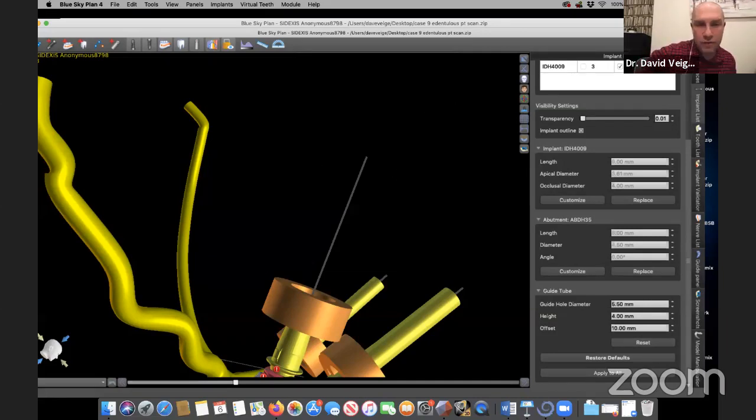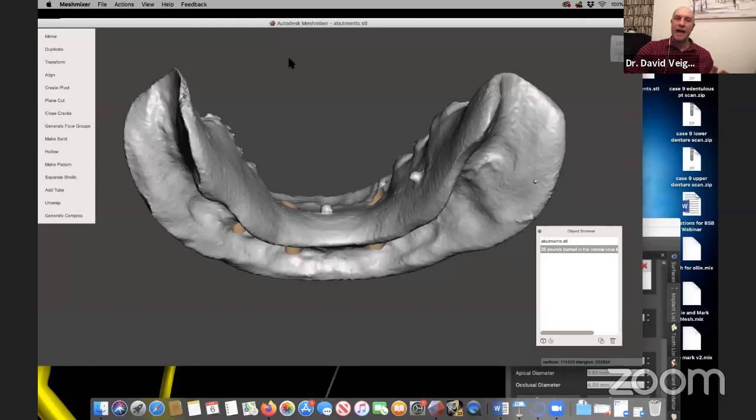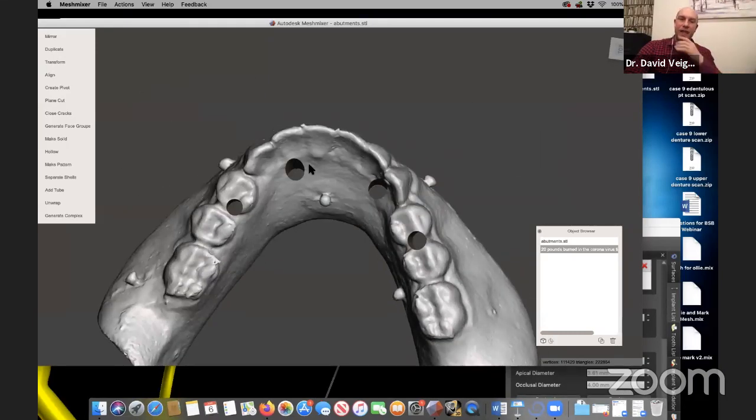How do you cater for the polymerization shrinkage? Yeah, you can't essentially. But the good thing about this type of pickup is that I don't have that much. If you can imagine, this hole is actually 5 millimeters in diameter, and my temporary cylinder is actually 4 millimeters in diameter.